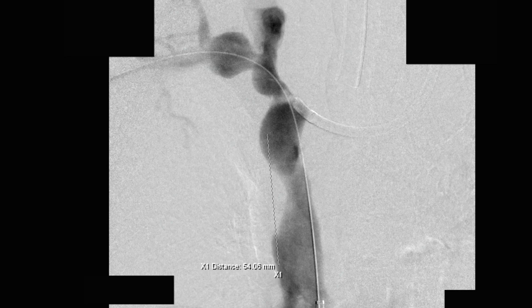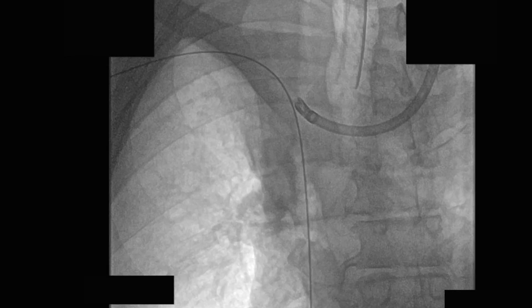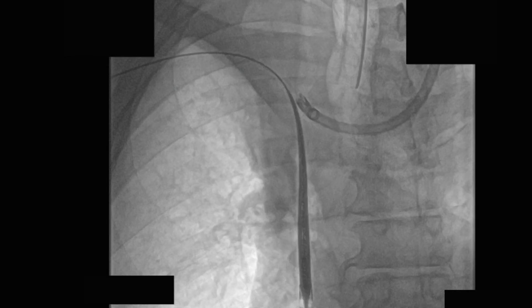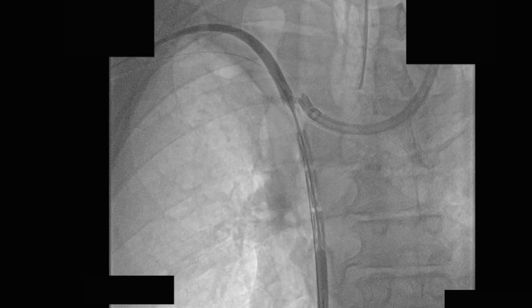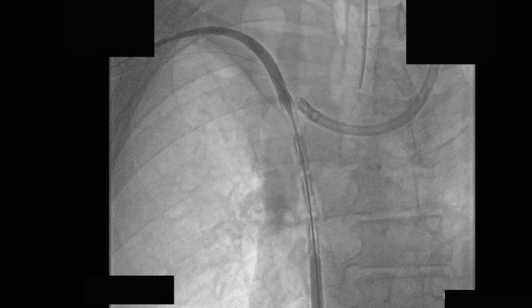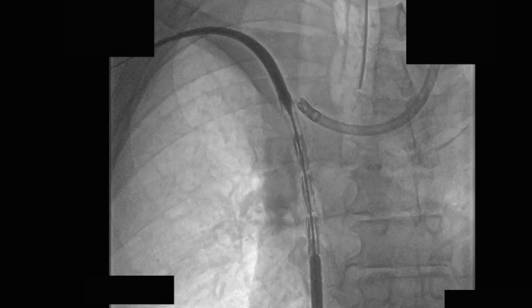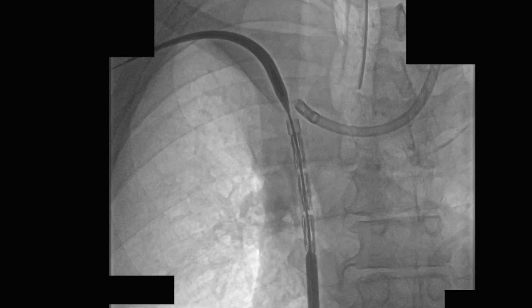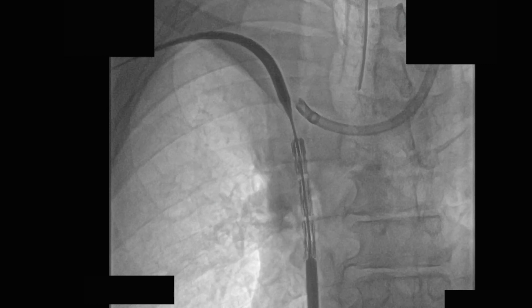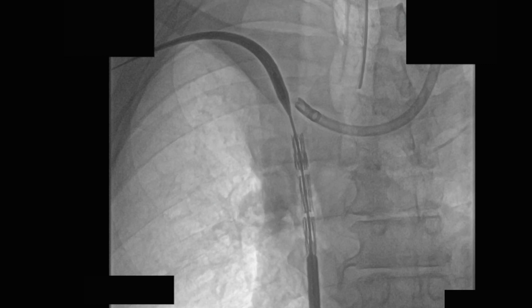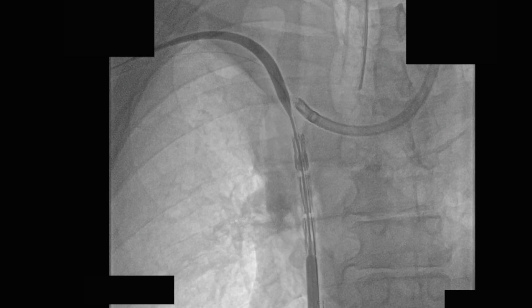Based on measurements performed off of the venogram, we decided to use a 24-millimeter in diameter by 55-millimeter in length Zenith endograft. After exchanging our 7-French sheath from the right groin for a 16-French sheath, we were able to bring the stent into position. Once placed in the appropriate segment, we confirmed with the overlay of the venogram to ensure we had covered the stenotic segment, then deployed the endograft per IFU.